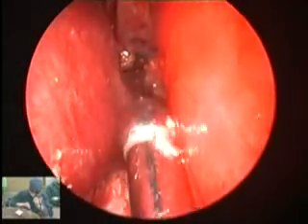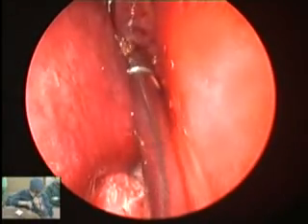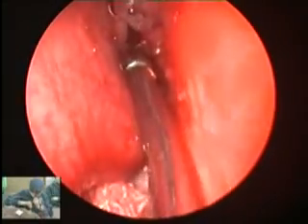So Sham, which technique for removal of the uncinate are you going to use? The swing door, probably.